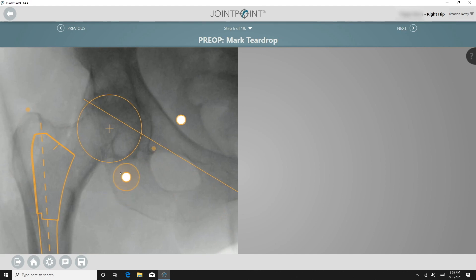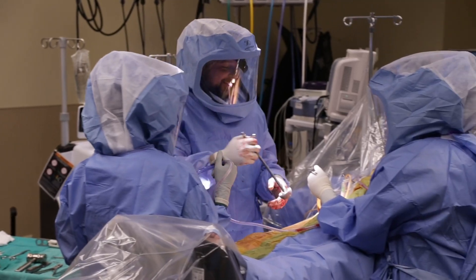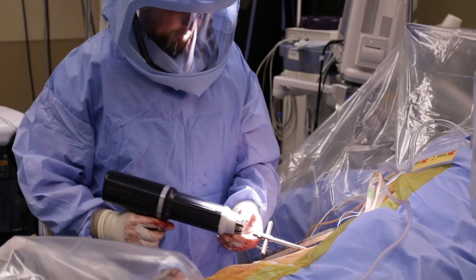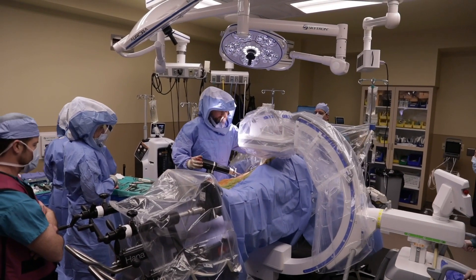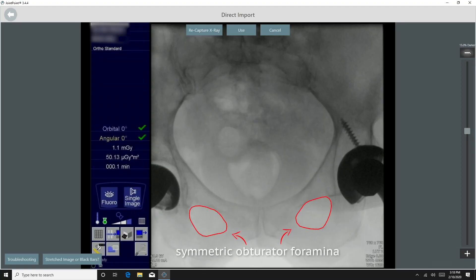Lastly, the teardrop is marked. After reaming and the acetabular cup has been selected, I place the cup into the acetabulum with the Concise attached, positioning it at what I think is the appropriate anteversion and inclination angles. A level pelvis is then obtained and the C-arm is brought back to a neutral position.